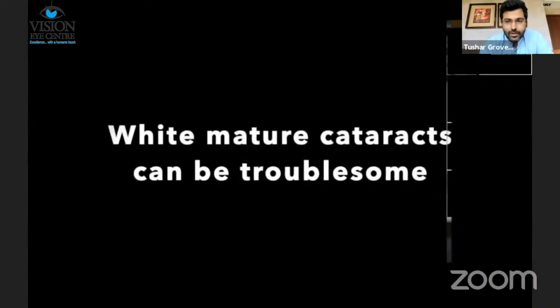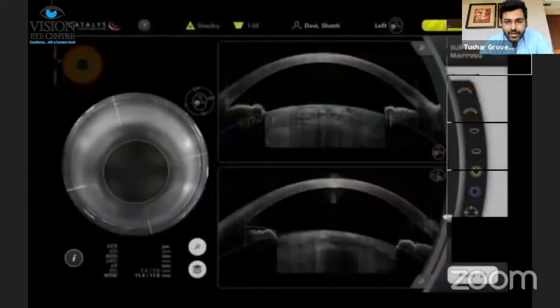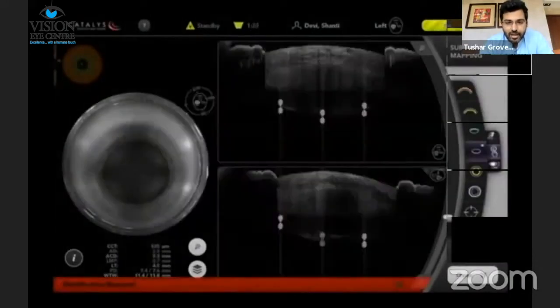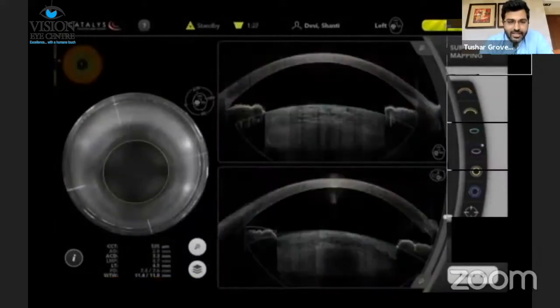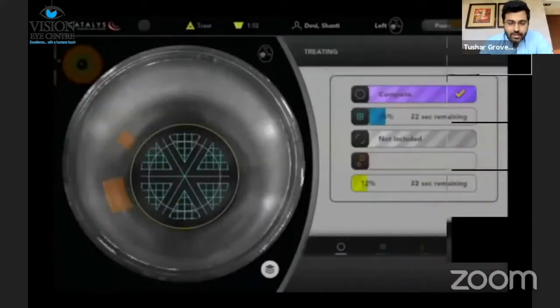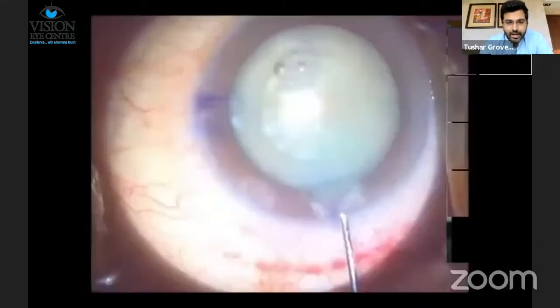Another situation where you can have these issues with capsulotomy is when you have white mature cataracts. We usually increase the energy settings and the depth of the capsulotomy in white mature cataracts because you can possibly have tags left behind — there is some milky cortex released at the time of capsulotomy, and it's quite common to have incomplete capsule tags left behind in white mature cataracts.